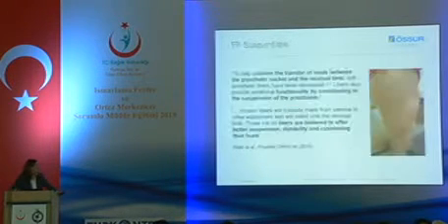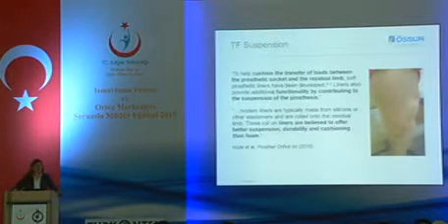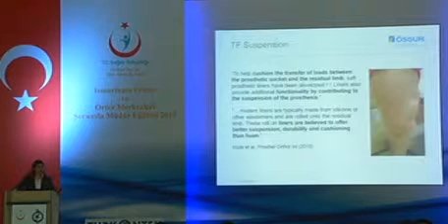So from this, once liners were designed for transtibial patients, it was then found that they can provide the transfemoral some good options as well.